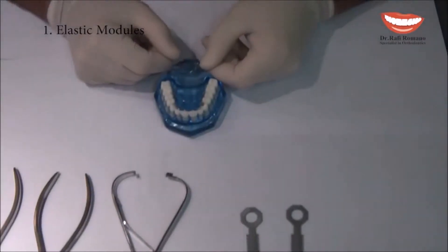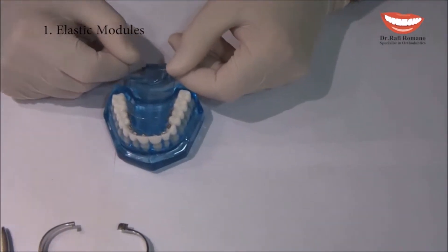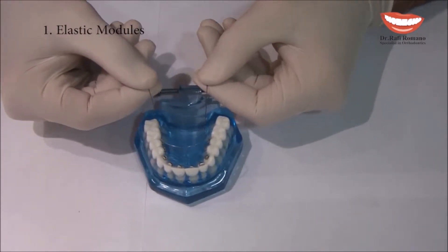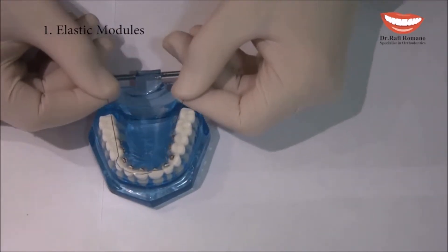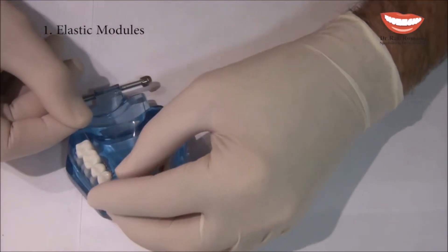So let's see the hands-on for elastic module ligation. First of all, we are preparing the mushroom wire, which can be passive or it can be active if we want to procline or expand.